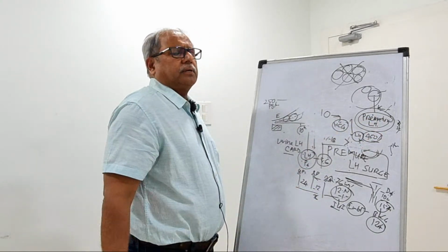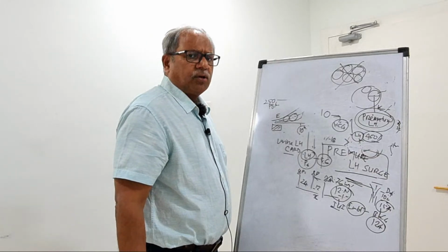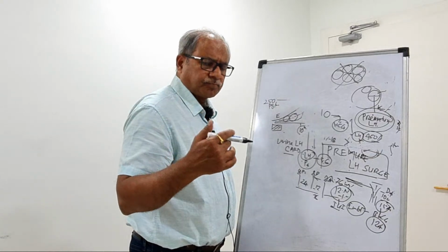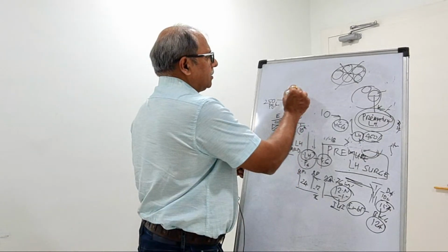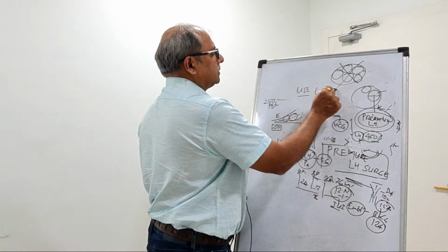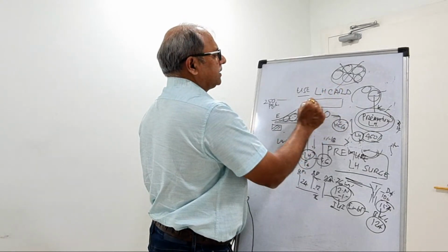But for a common setting where the problem is that LH is not being done, or you have to send the sample outside and get the result after 2-3 days, use the LH card. The LH card is just like a urine pregnancy test.